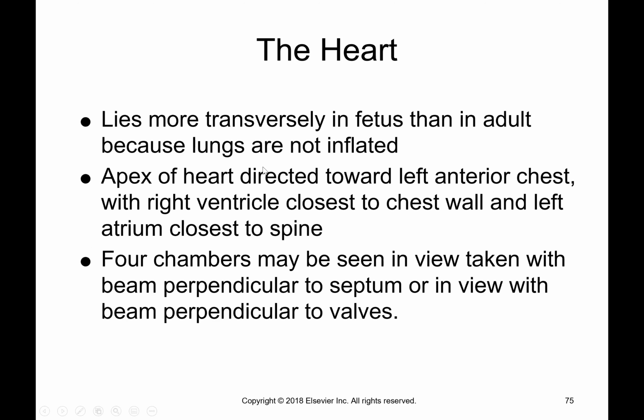The heart lies more transversely in the fetus than it does in the adult because the lungs aren't inflated. And the apex of the heart is directed toward the left anterior chest, with the right ventricle closest to the chest wall and the left atrium closest to the spine. And you want to see a four chamber view.